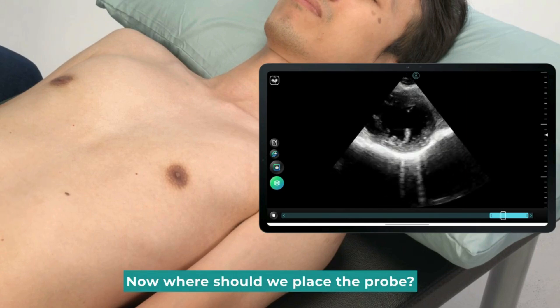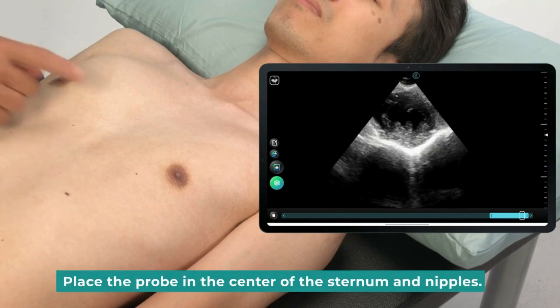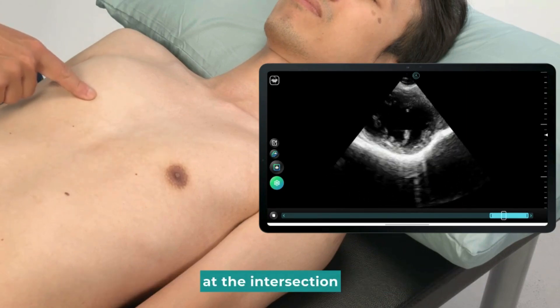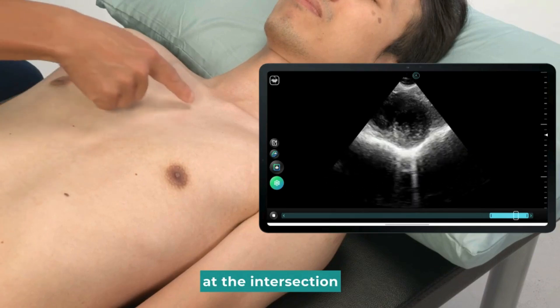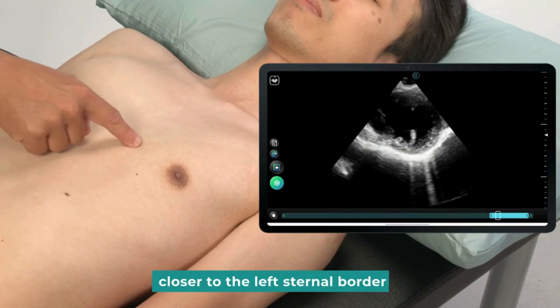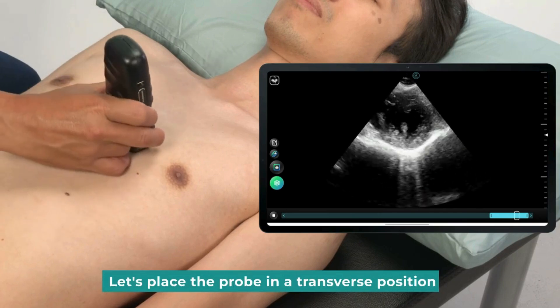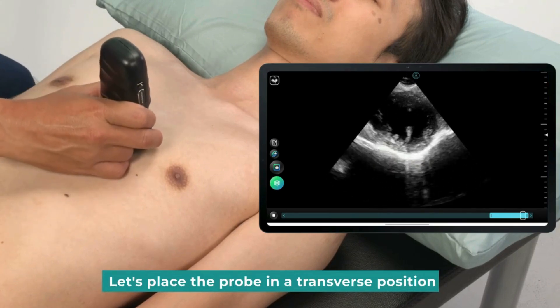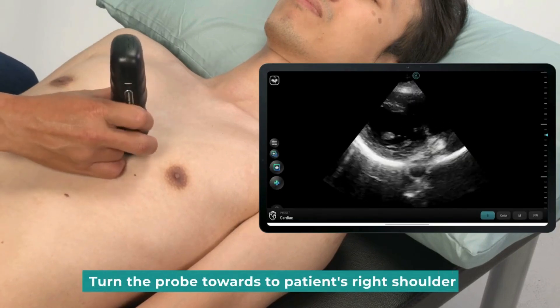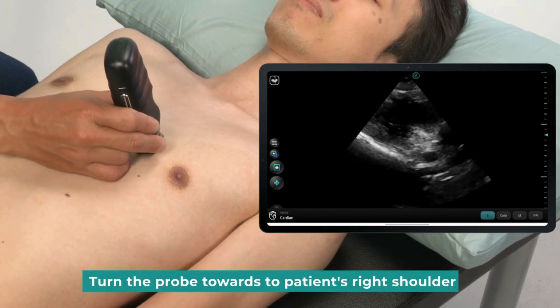Now, where should we place the probe? Place the probe in the center of the sternum and nipples, at the intersection, closer to the left sternal border. Let's place the probe in a transverse position, then turn the probe towards the patient's right shoulder.